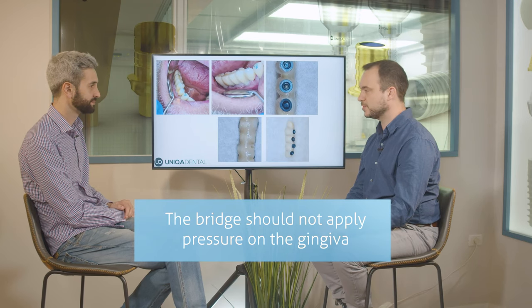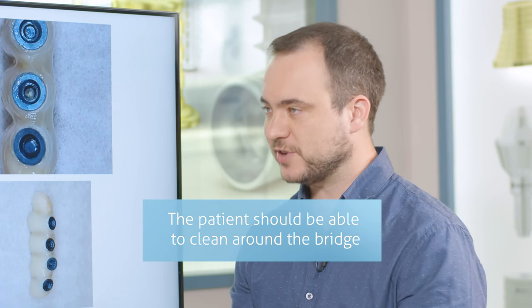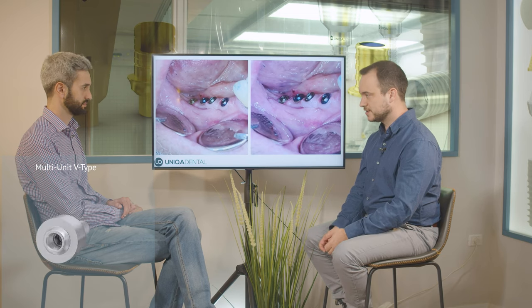You don't want the bridge to apply pressure on the gingiva, and you want to give the patient an option to clean it — that's the most important part. You want the patient to be able to clean beneath the bridge and maintain the implants and all the constructions, because good maintenance means much greater longevity of the implants. Could you use D-type multi-units in this case? Probably not — because of the lack of interproximal space and the proximity between the implants, the D-type multi-unit is bigger in diameter and height, so the patient would have difficulty with maintenance.